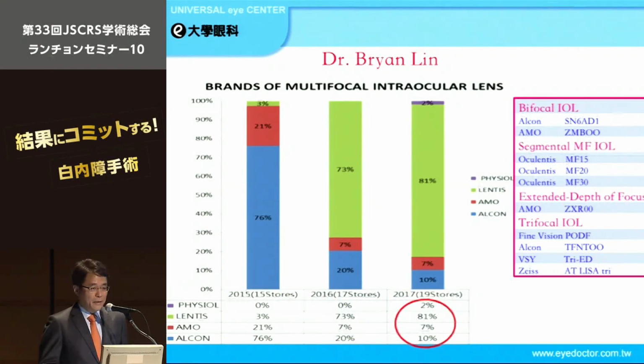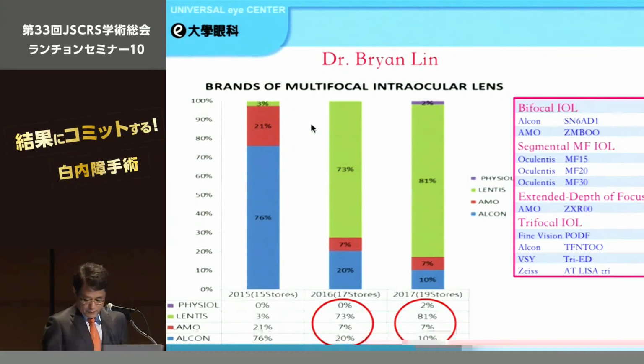In the past 2 years, Oculentis is my favorite used multifocal IOL.